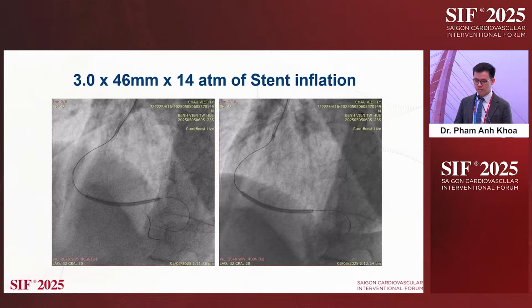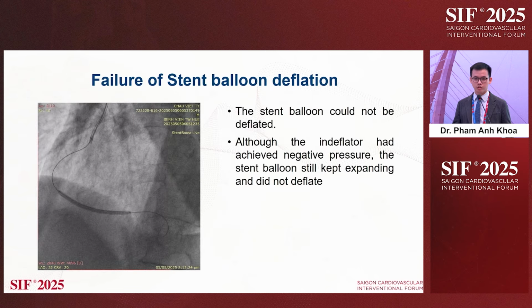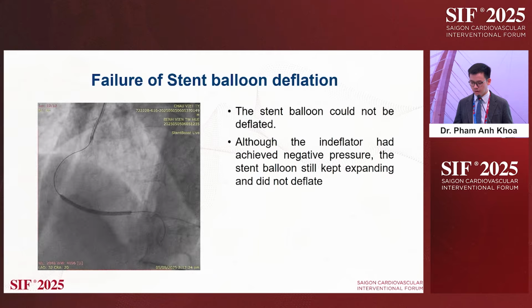the PDA wire, out. And at that time I did not know the correct thing to do. So I had to stop, and the patient at that time was quite conscious and did not have any chest pain immediately. So I checked everything again, and I saw that we had to do this another way.